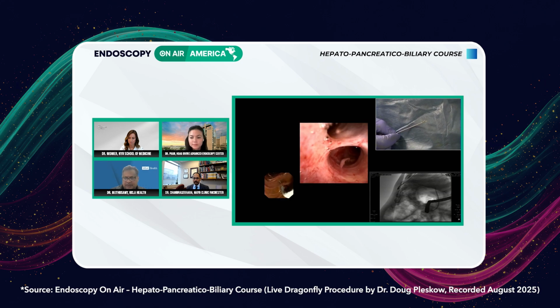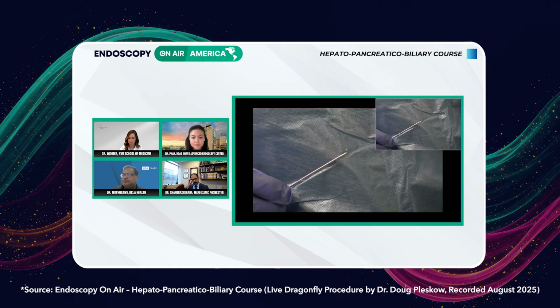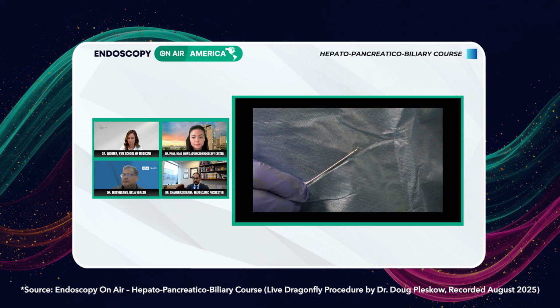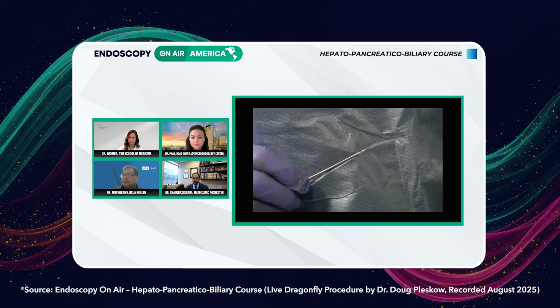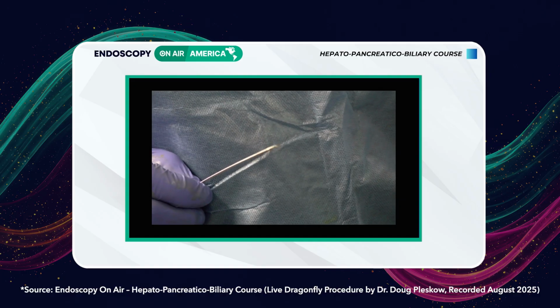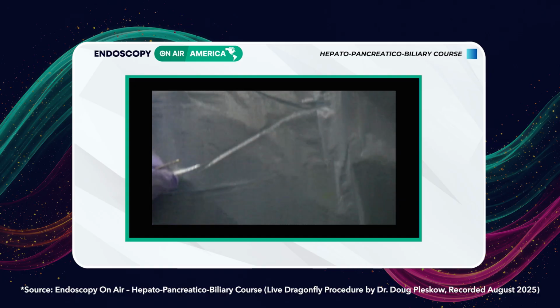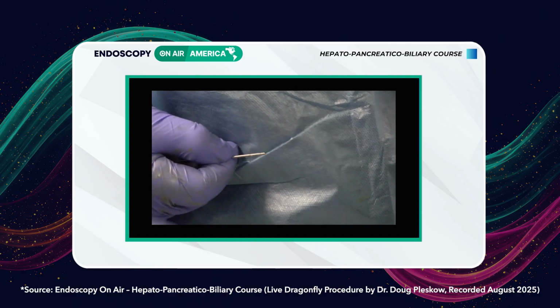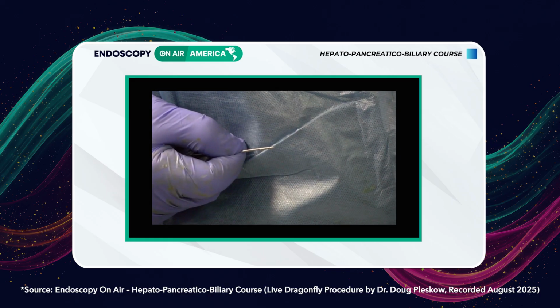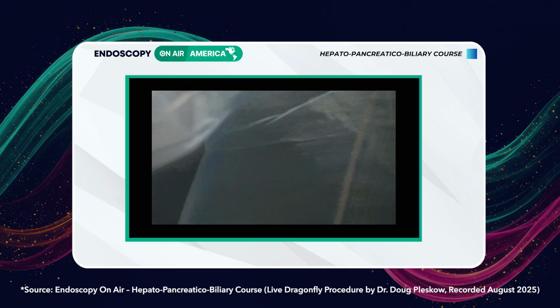Open G. Okay, so you can see that's pretty good size, and then a 6 millimeter tip. And he'll show you how we walk the dog. I don't know why we called it walking the dog, but yeah. Kusami and I were just laughing because we use the same terminology as well. There you go. Walking the dog.